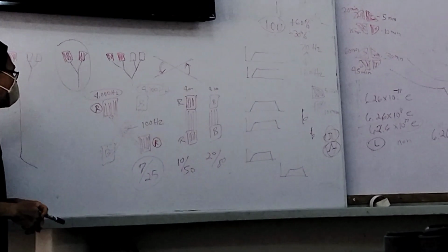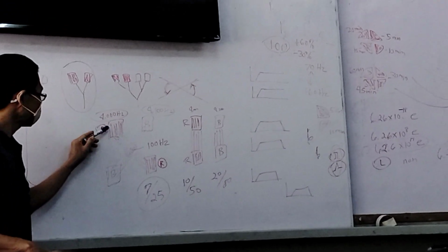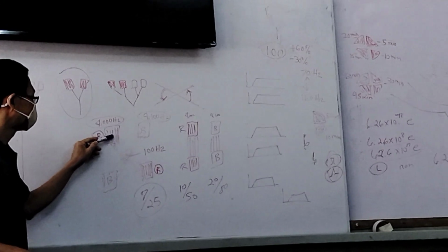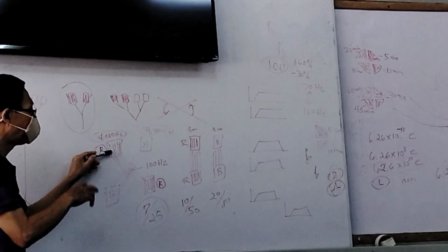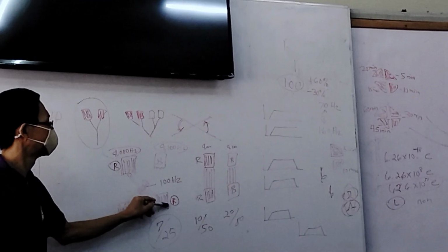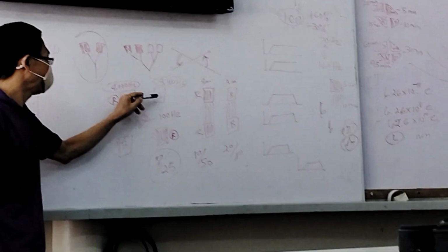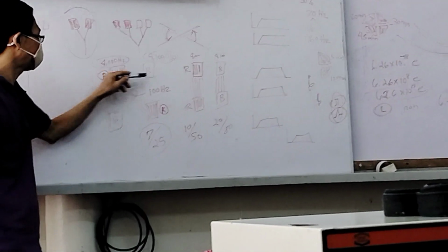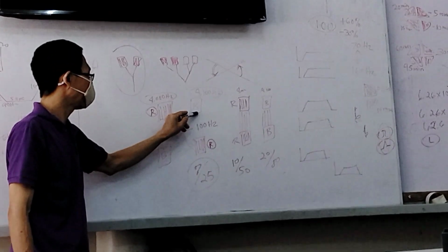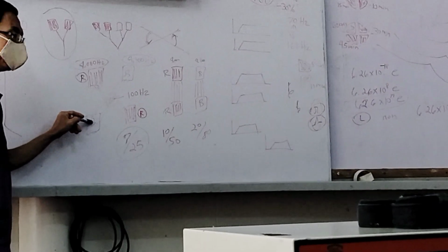That is why I mentioned red is the partner. If you place the red here, you have to place the partner red for this modality on the other side. And for the black, that's its partner. The black partner electrode should also be placed on the opposite side.